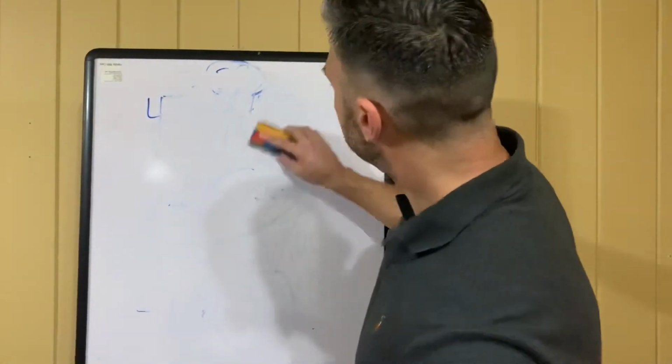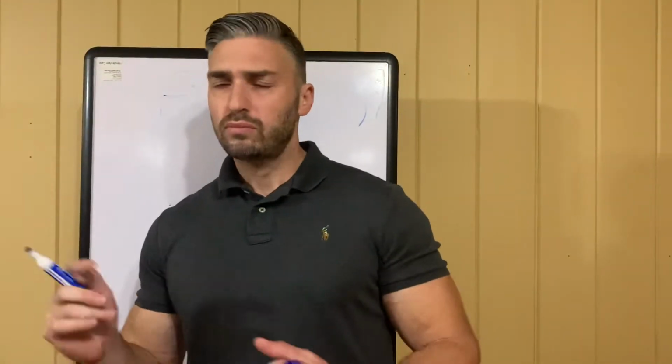So some facts that you want to know that are going to help you answer some of these. Well, before that, if the question says to fit this lens half a diopter flatter than K or half a diopter steeper than K, whenever you see steeper than or flatter than K, you have to think of an acronym, SAM or FAP, F-A-P. Steeper add minus, flatter add plus.